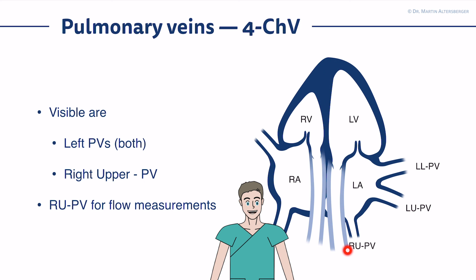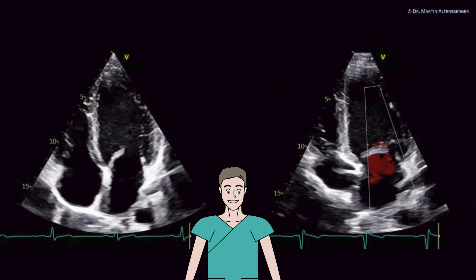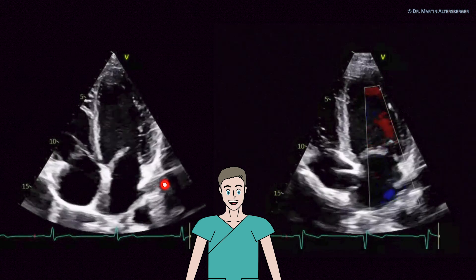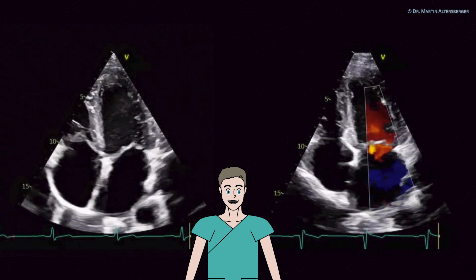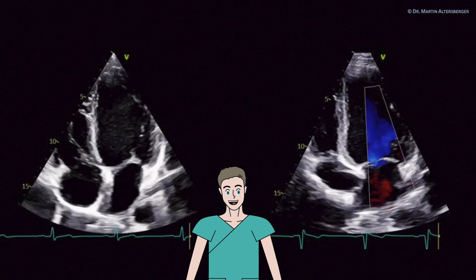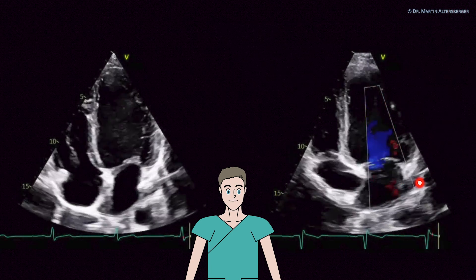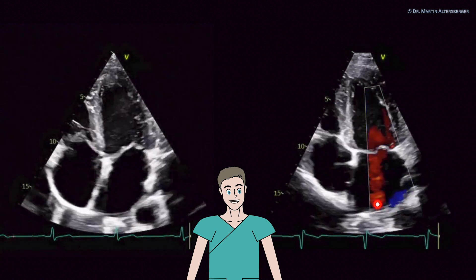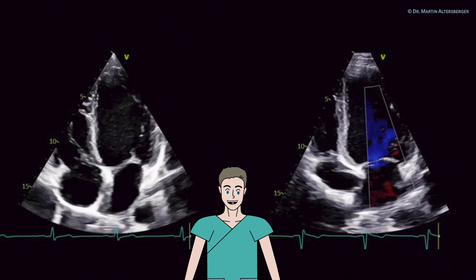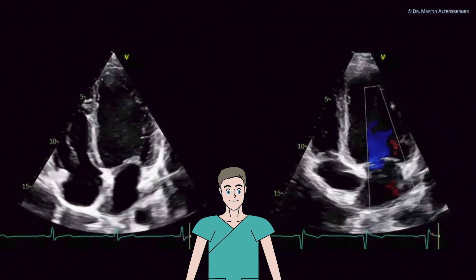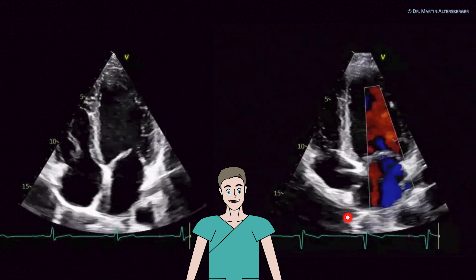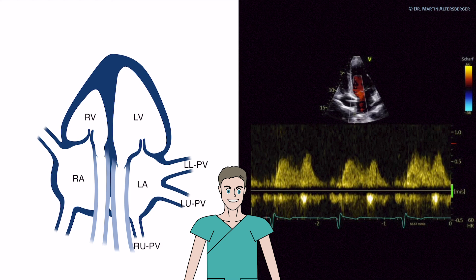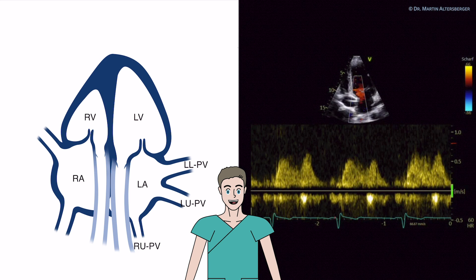In TTE it is sometimes very difficult to visualize all four pulmonary veins, but keep in mind that the right upper can be visualized and used for measurements optimally. You see here a vascular structure, and here another structure that might be the left atrial appendage. With color Doppler, we do see flow coming into the left atrium. We have to find the right upper pulmonary vein — optimizing towards it and placing the pulsed wave Doppler, we get a signal.